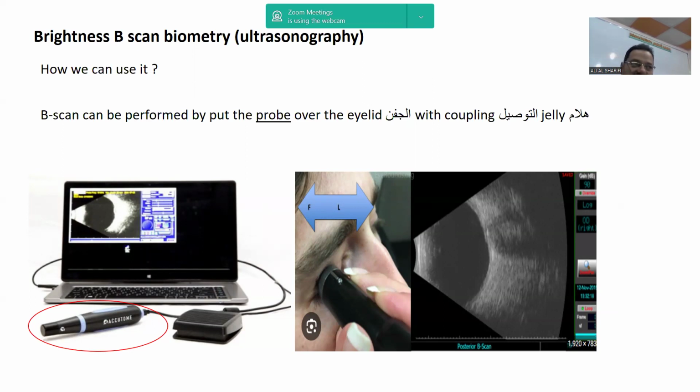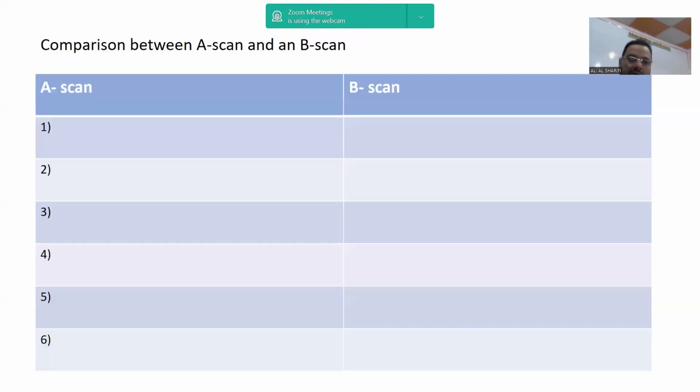Here is some symmetry with the same technique: when I explained the ultrasound device, I said you will use some gel to make your body absorb as many ultrasound waves as possible. Here, the same idea applies, because we're using a coupling jelly with the same target.